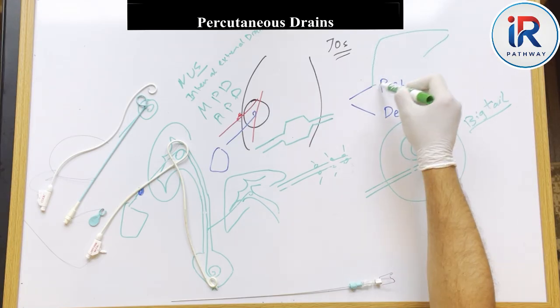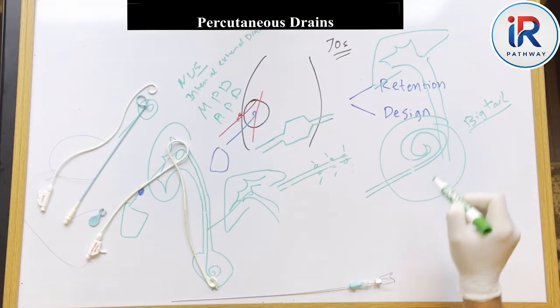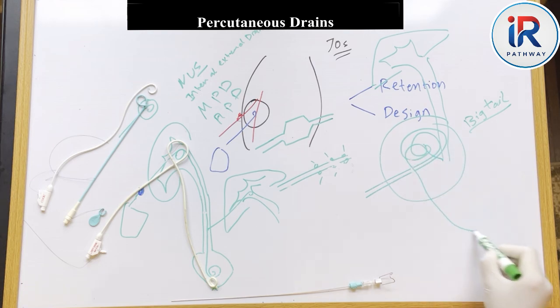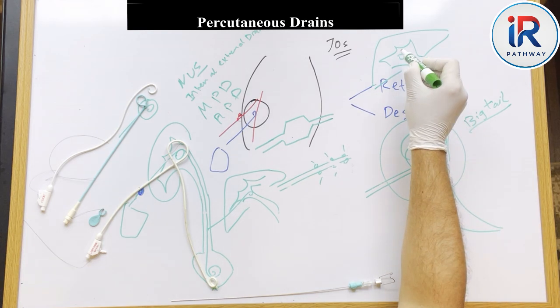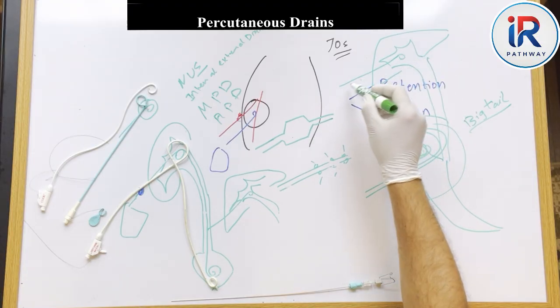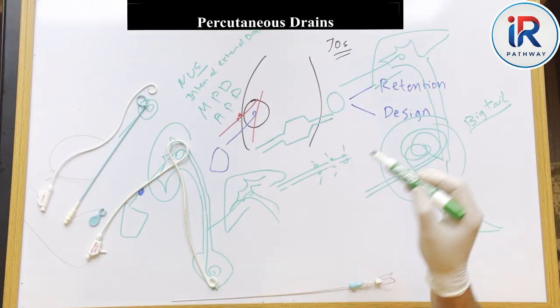Assume this is the liver, like this, and we have biliary dilatation, and here is the CBD, common bile duct, going down to the duodenum. Okay, we can place a pigtail catheter like this, bringing it outward, so all the bile here will drain outside and be collected.